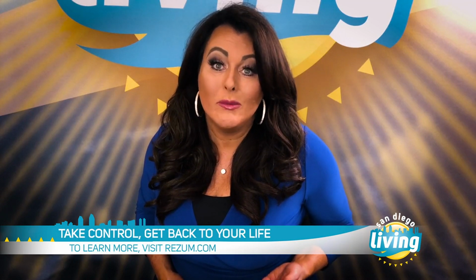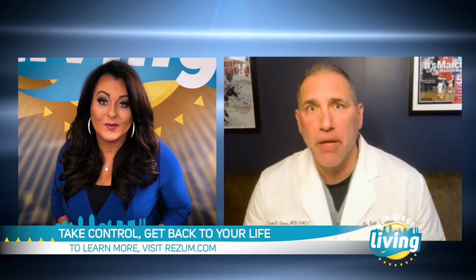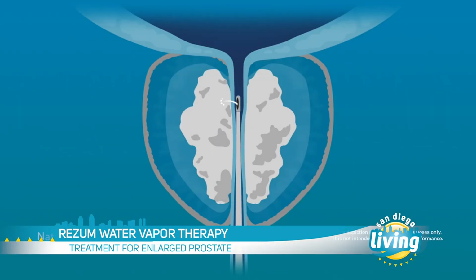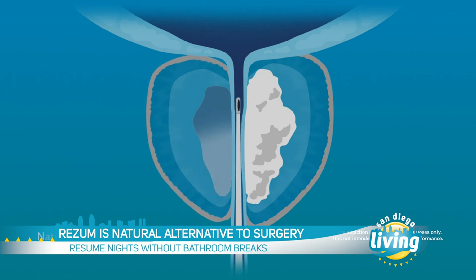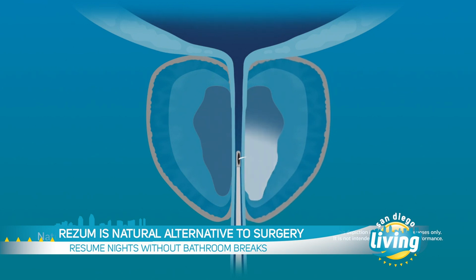Tell us about this new minimally invasive treatment called Rezum. Yeah, Rezum is one of the newer minimally invasive ablative procedures where we steam the prostate. And by steaming it, we get the prostate to shrink over time. We put a scope into the urethra. We then inject steam into multiple locations within the prostate, each blast lasting 9 seconds worth of steam. Over time, this causes those cells to die, and they'll essentially reabsorb, and it will reopen the channel over time, which will improve your urine symptoms.